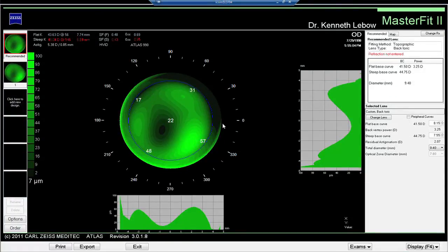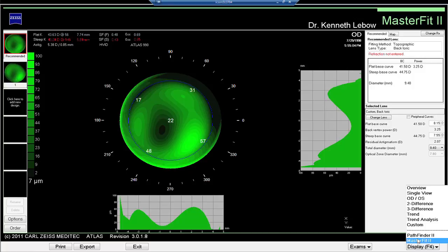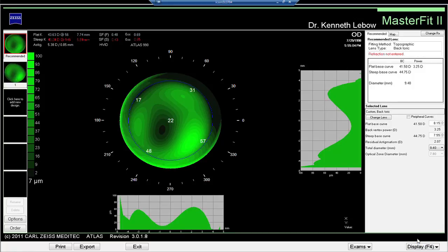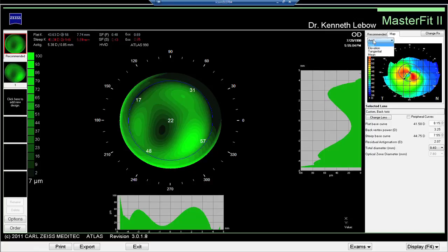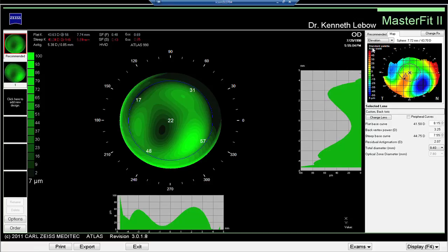I clicked on MasterFit and it loaded the topography image. You can see the axial map of the keratoconus. What we really want to look at is the elevation map. The computer has designed a contact lens for us — in this case it defaulted to a back toric contact lens, which in my opinion I would not recommend for a keratoconic eye.